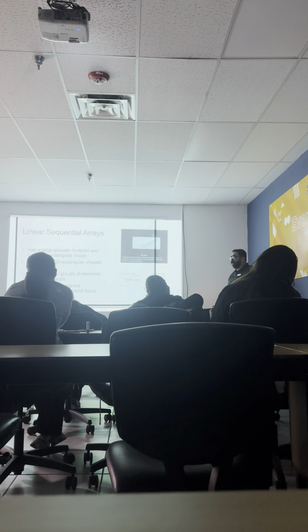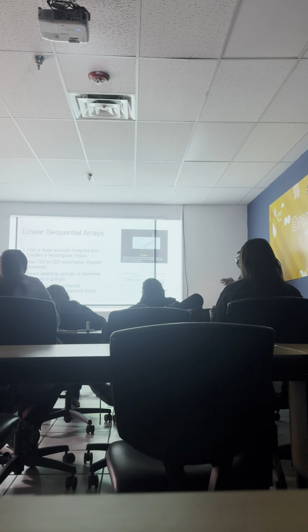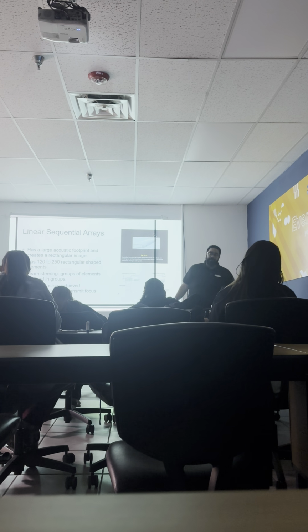Is a rectangle good or bad? It's good, but we can make it better. Remember how we have axial and lateral resolution? We also have elevational resolution, or slice thickness resolution. So the taller the crystal, the poorer the elevational resolution.